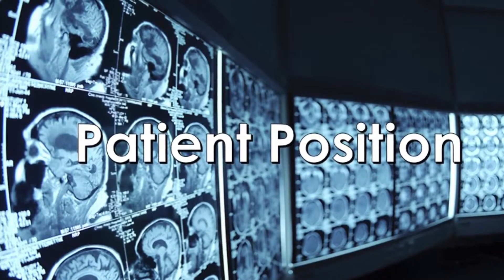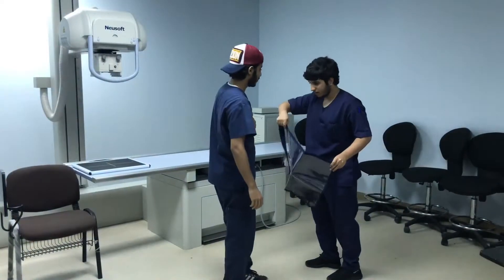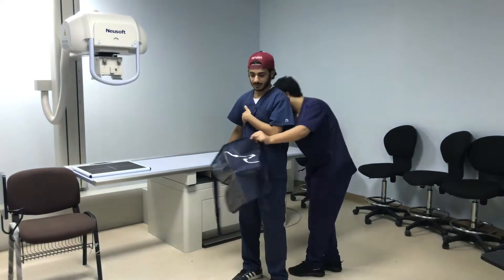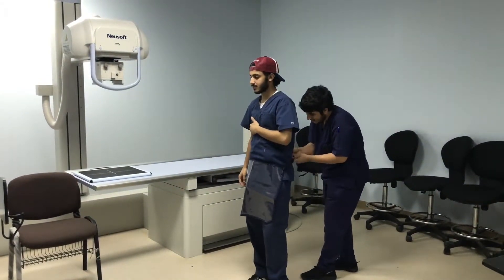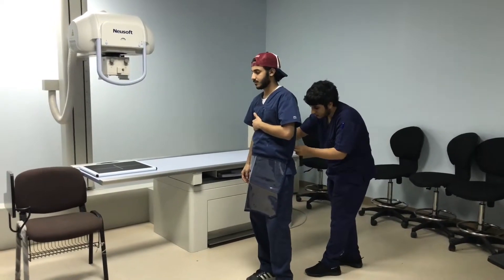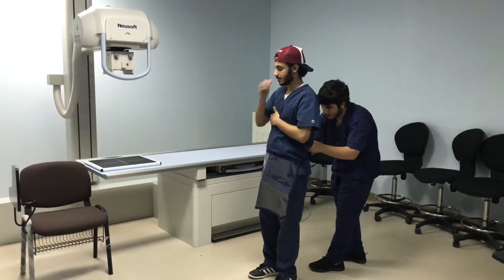Now let's go for the patient position. First of all, sensitive organs in female or male bodies must be covered with a shield made of lead in order to protect them. The patient must sit at the end of the table with his hand and arm fully extended.